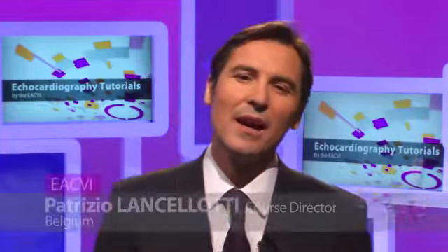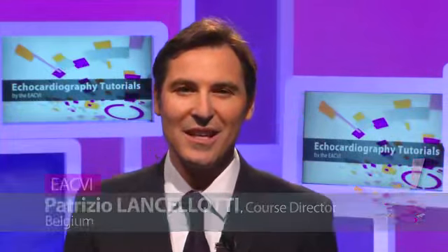Luna Gargani will highlight the usefulness of echocardiography in critically ill patients through a series of illustrative cases. She will also focus on what to look for using a step-by-step approach that focuses on the main clinical condition. In critically ill patients, the echocardiographic approach can be different according to patient's condition. So the examination should be focused on the main clinical suspicions.